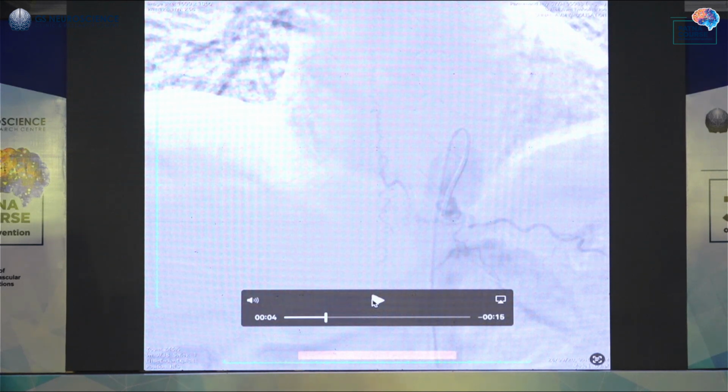Now let's see how this case went. Somebody was asking about the angioanatomical correlation. So basically, you are at the intercostal artery here. This is the somatic branch, or the intercostal artery proper. And these are the branches which are going towards the neural axis. What you are seeing are these tiny branches that are ramifying on the dural sleeve of the exiting nerve root.